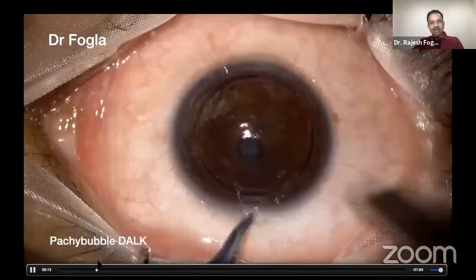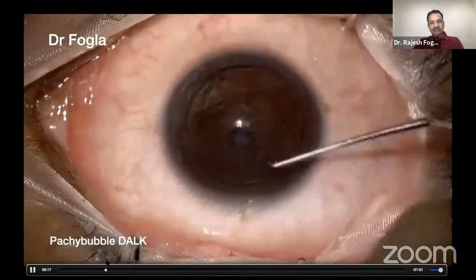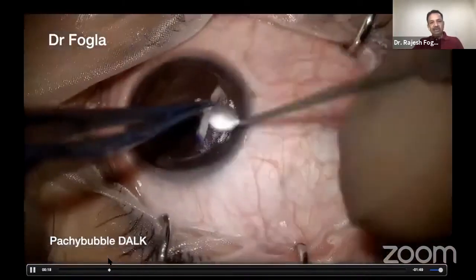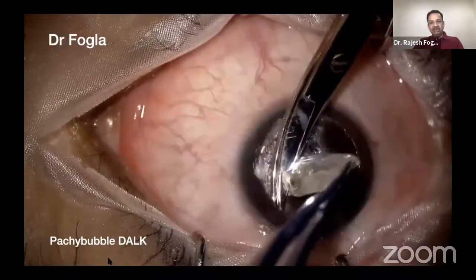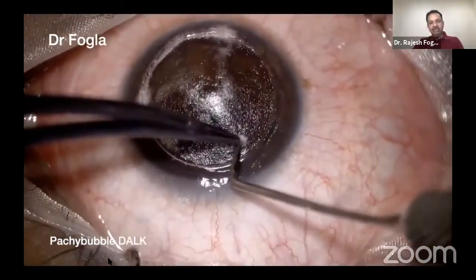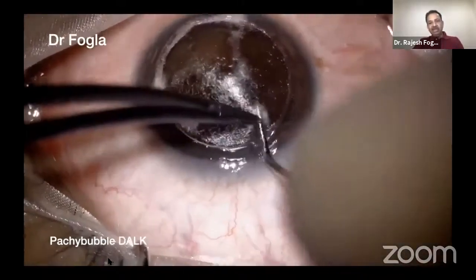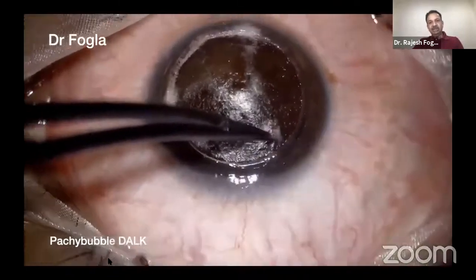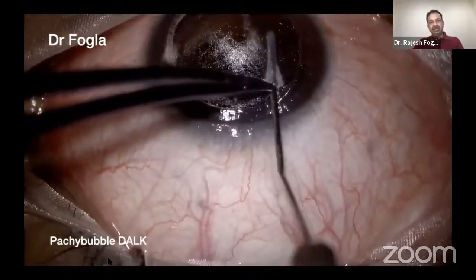And then you can make a 1 or 2 millimeter cut. I use a Sinskey hook marked with ink to identify the cut that I have made. And then I go with the suction trephine, and this can be like a 50-60% trephination. You can debulk. Now what happens is you go to the base of the diamond knife cut that you have made. Because this is already at 90% depth, you can make your track from that point, put your cannula, and then you can create your big bubble.